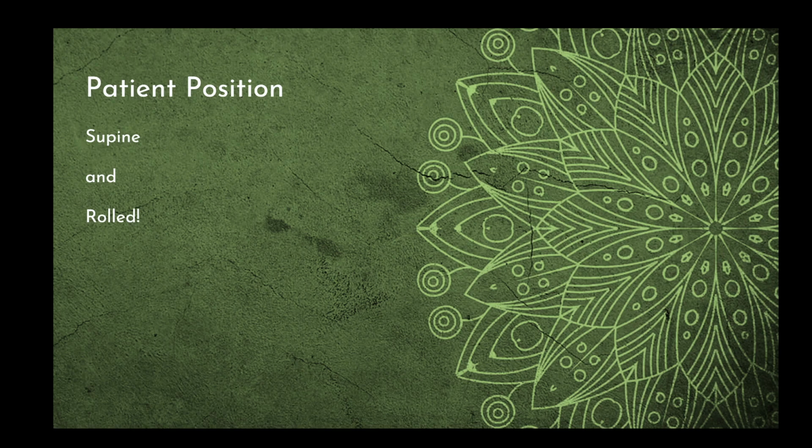And so I take pictures of the gallbladder in supine, both in long and transverse, and then we want to roll our patient. And it might be kind of weird, why are we rolling the patient? Well, the gallbladder is really floppy, and we want to see what happens when we roll the patient. We want to see what the gallbladder does. And when the patient is on their back, their gallbladder fundus hangs more towards their feet. When we roll them onto their left side, that gallbladder fundus will kind of roll then to the left side as well. So it changes the position of the gallbladder.